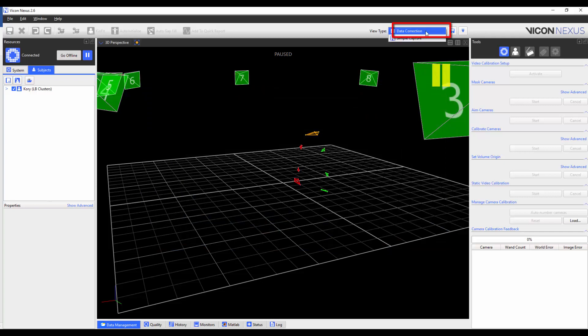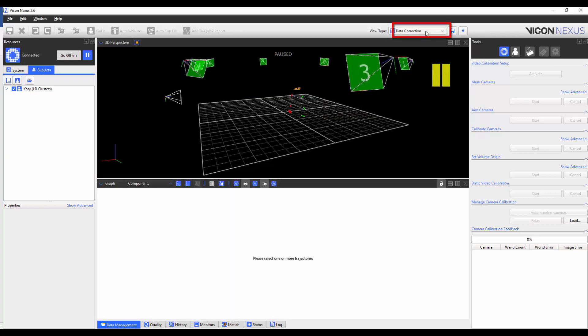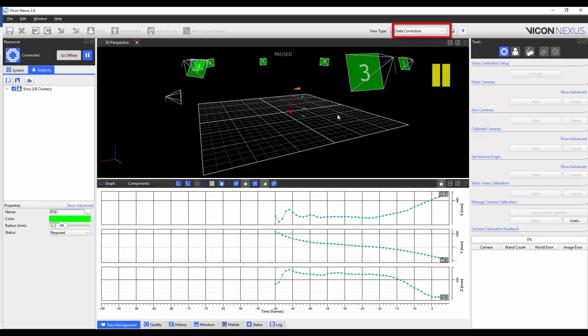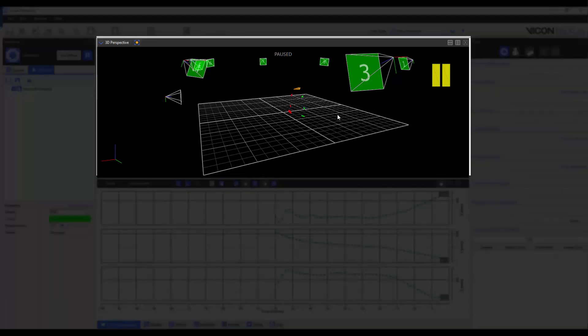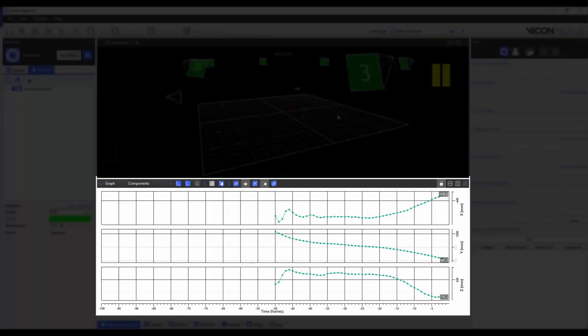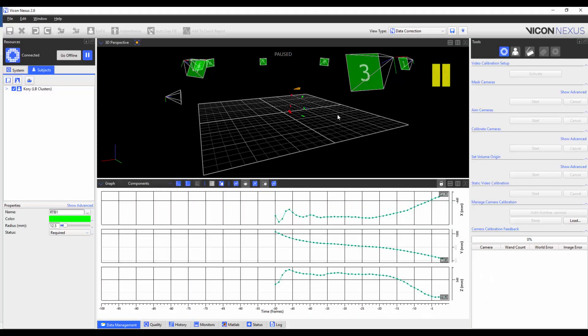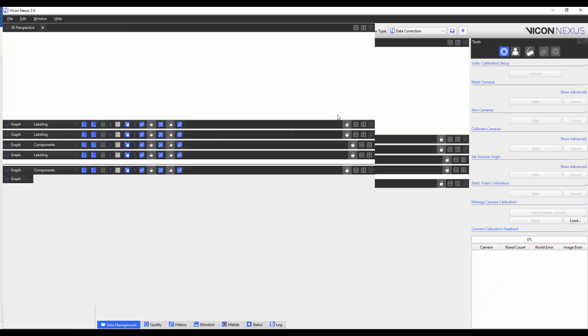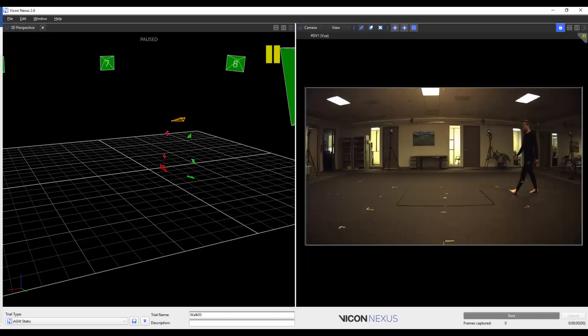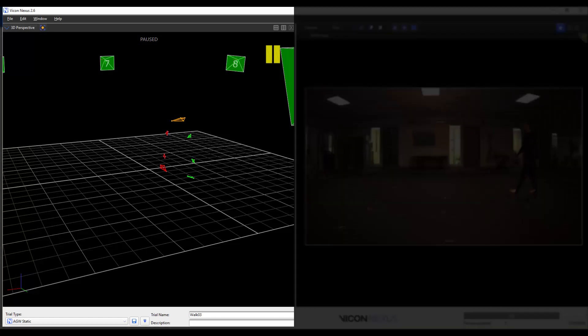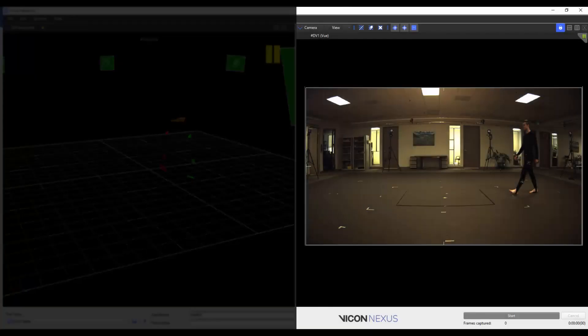As you can see, I've got the Data Correction view type selected, where I've got my 3D perspective on the top, and the Data Correction graph below. When I go to the Simple Capture Mode, we can see that instead, the Simple Capture view type is being displayed, where I have the 3D perspective on the left-hand side, and the camera view on the right.